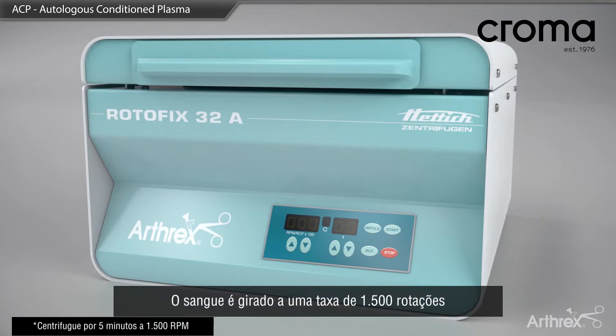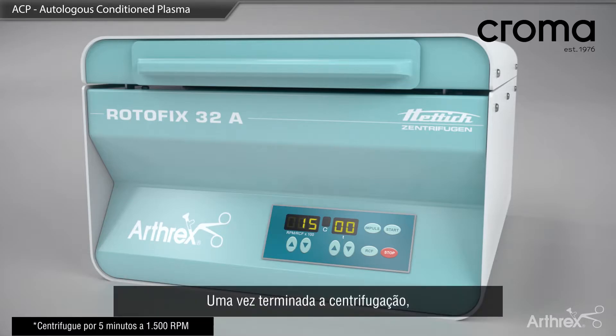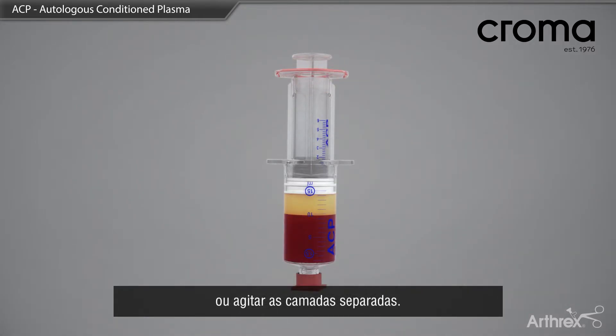The blood is spun at a rate of 1500 revolutions per minute for 5 minutes. Once centrifugation is complete, the double syringe is removed from the bucket, taking care not to tip or agitate the separated layers.